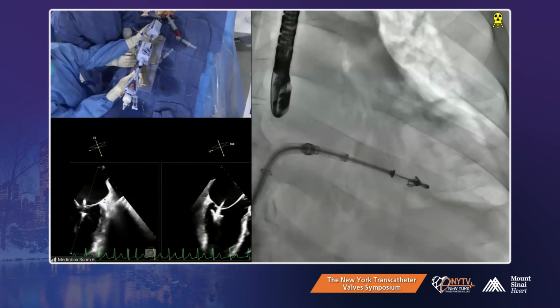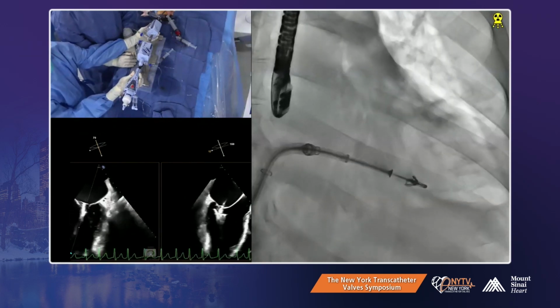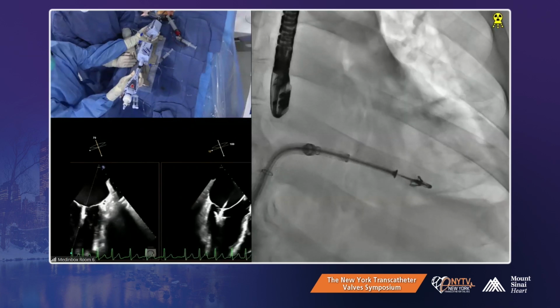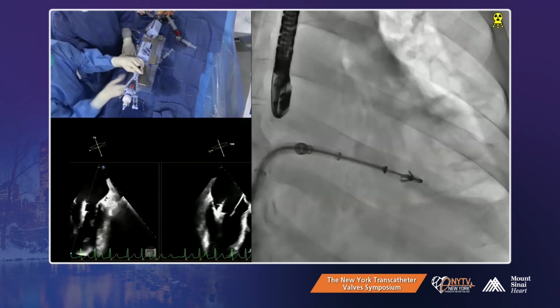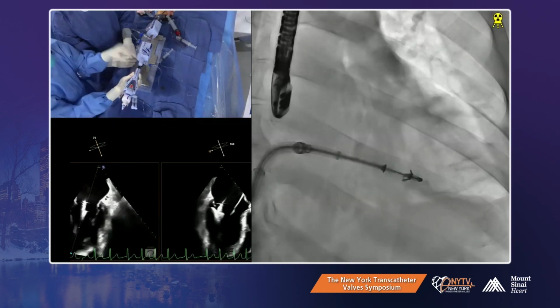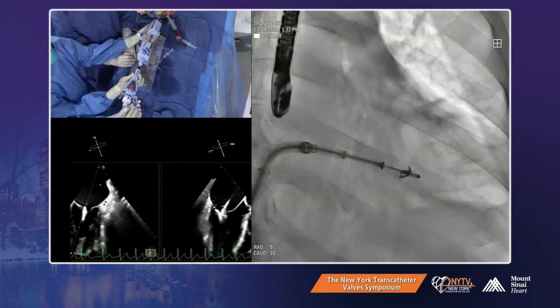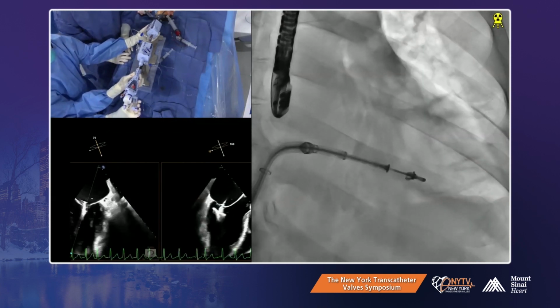But the thing is we actually have more than 180-degree plus. I know that, and the reason for that is because your puncture is not posterior. If you had a posterior puncture, or a low transseptal puncture, you wouldn't be so biased. Yeah, if your puncture site was slightly lower or a little bit more posterior, you would not have had this much bias. That's making it challenging.